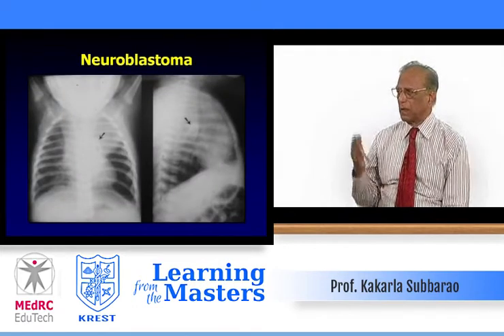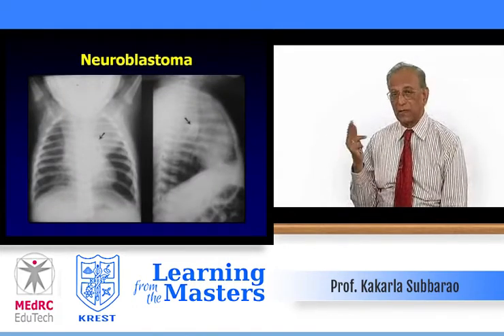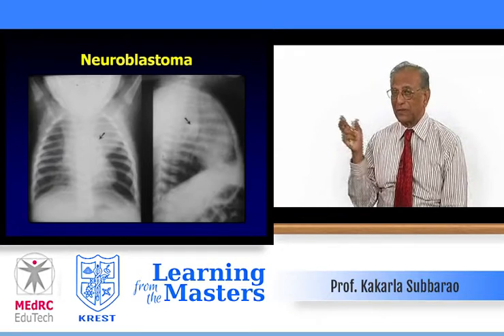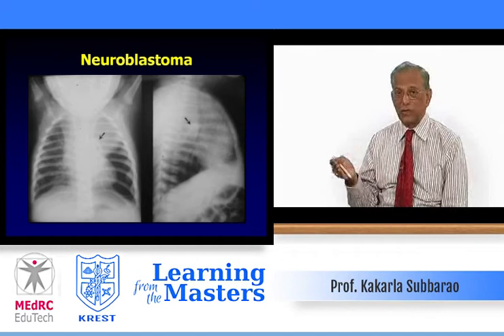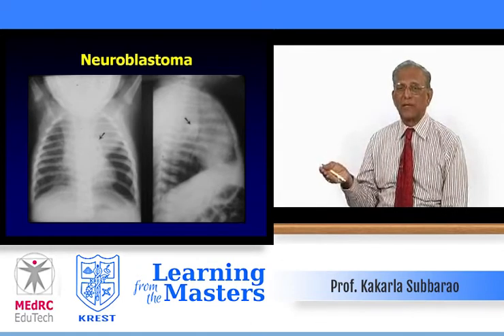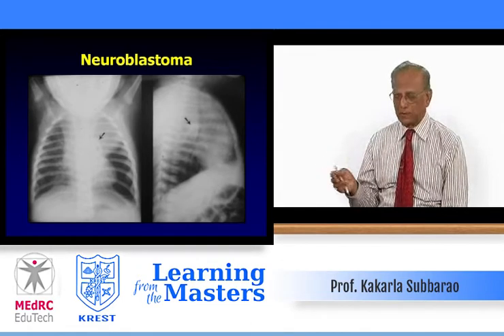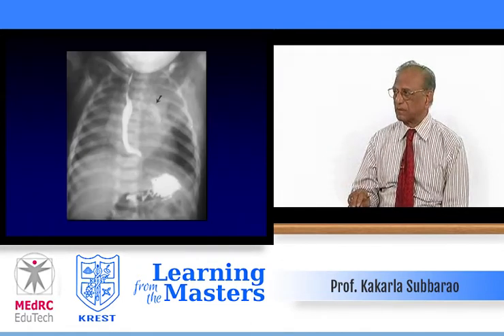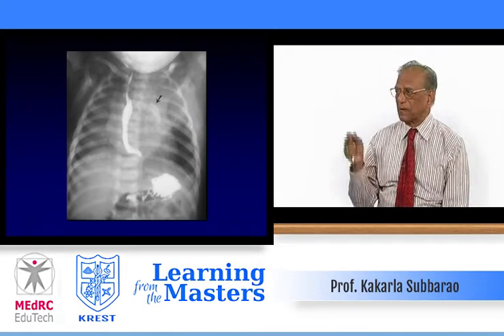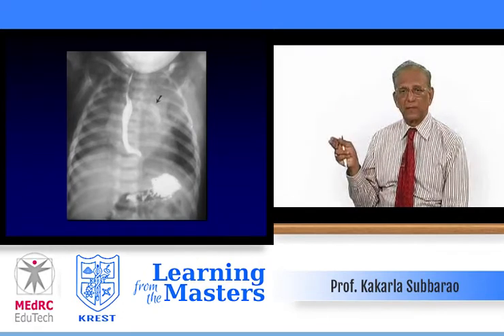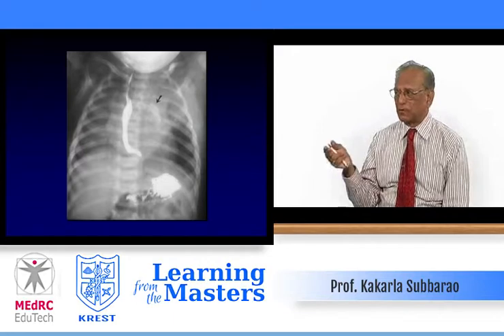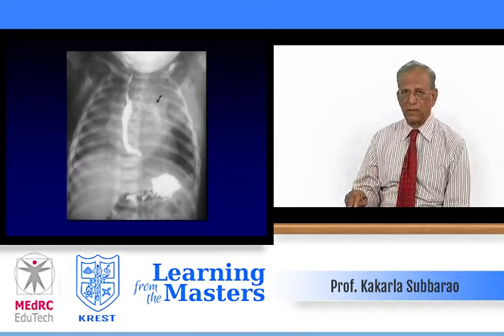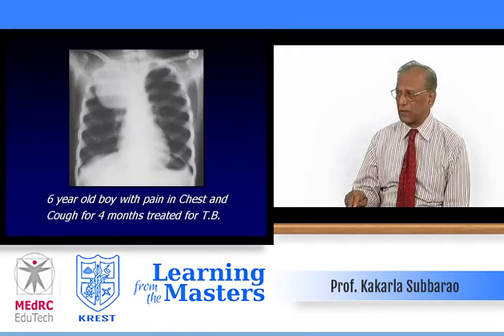Neuroblastoma: I showed you earlier a similar mass in the anterior mediastinum with calcification; here it is in the posterior mediastinum with calcification — neuroblastoma. Another example shows curvilinear calcification in the posterior mediastinum — neuroblastoma deviating the esophagus to the right side.